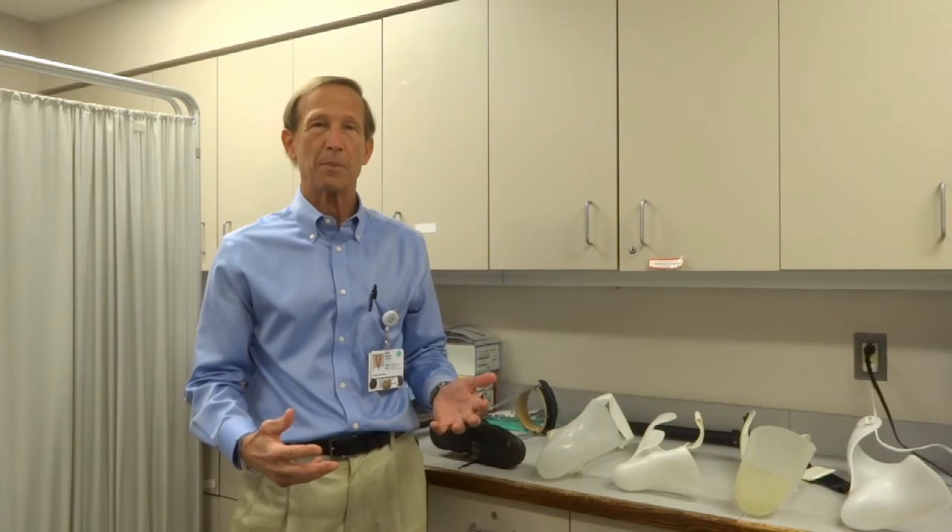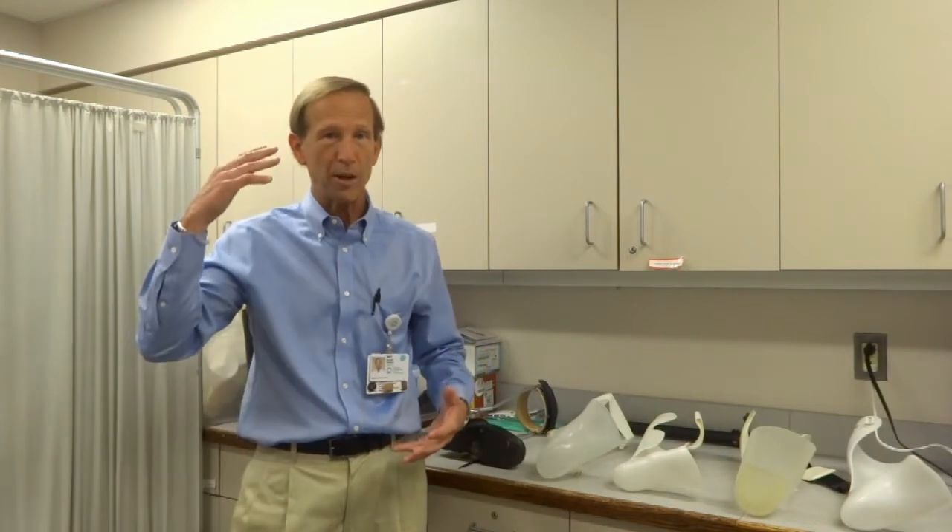Hey, it's Dr. Ustall again. Welcome back. Today we're going to talk about orthotics, which are different from our other segments on prosthetics. Orthotics are braces that go on a body part that's still there, where perhaps there's weakness or abnormal movements that we would like to control. Sometimes this occurs from damage to nerves in your leg or arm, sometimes from damage to your spine or brain.